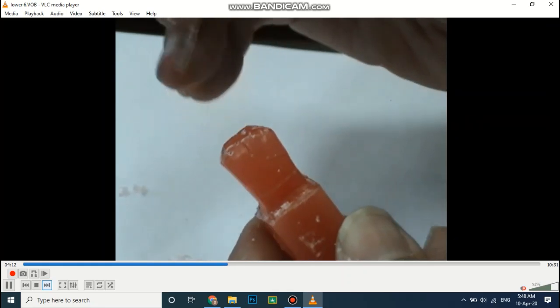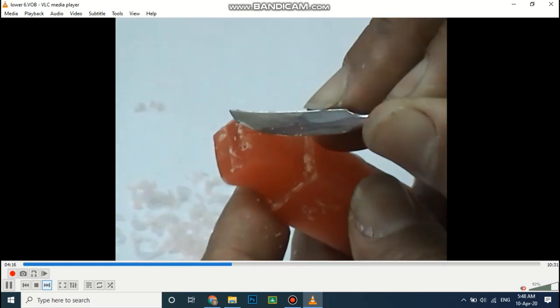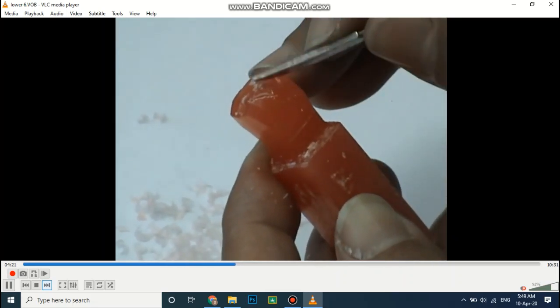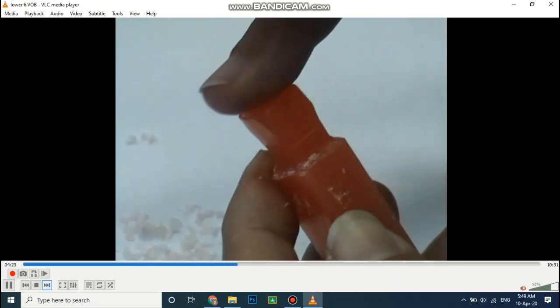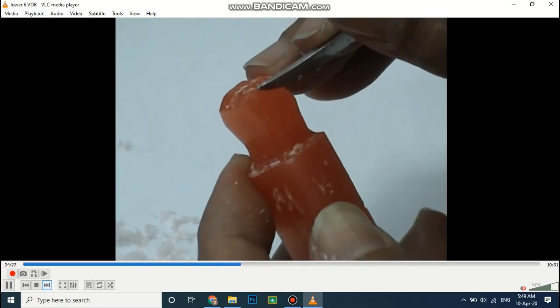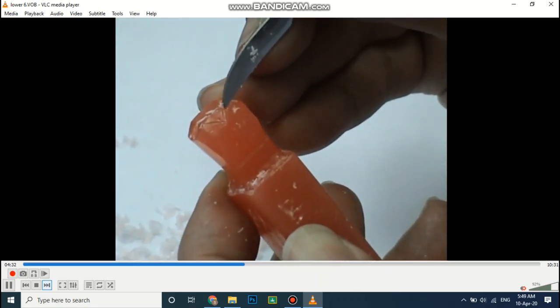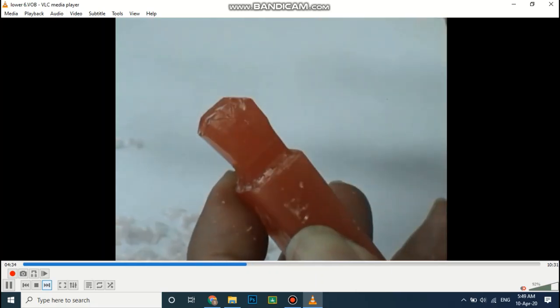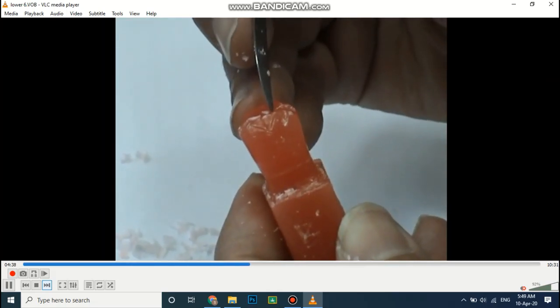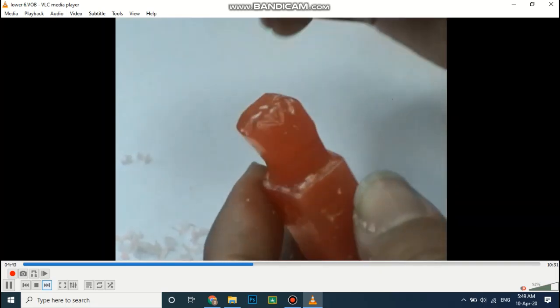Each cusp tip is connected with the 2 mm line that was drawn previously, and a V-shaped notch is created as we see now. Regarding distobuccal and distal, just half of the V shape is drawn to keep bulk for the distal cusp. Now we have 3 cusps buccally.